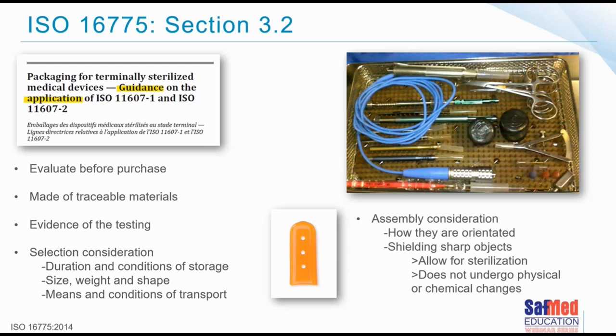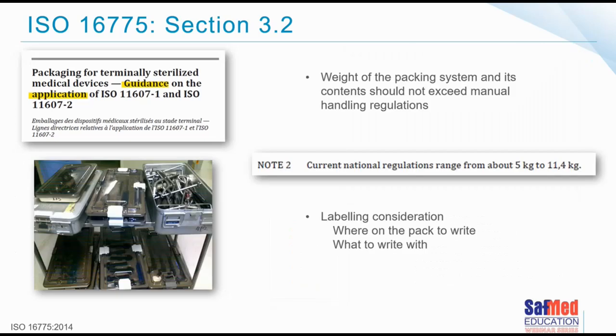So if you take that into consideration, you may ask yourself, is it a good idea to make use of tip protectors made of Jacques catheters or feeding tubes or silicone tubing that we create or use? Is it a good idea to clamp our sharps like skin hooks in elastic bands? Is that really a medical device? Things to think about.